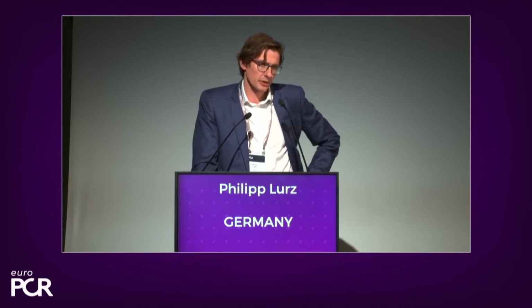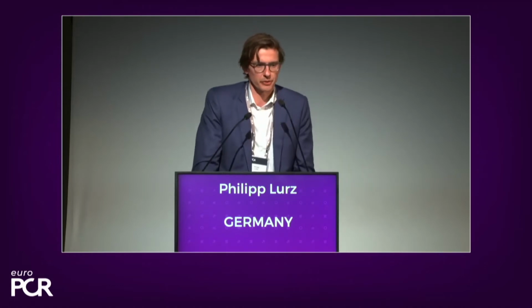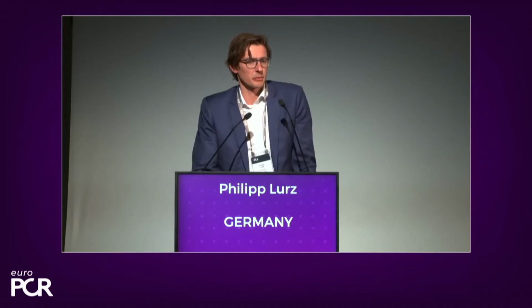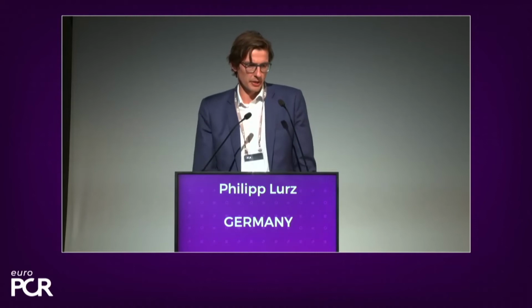And you could also see that although we had a sort of acceptable or even good result with the first grasp, we thought that it's important not only to look for color, but also for the anatomy and see whether there is still prolapsing or flail tissue left, and that's why we moved more medially.